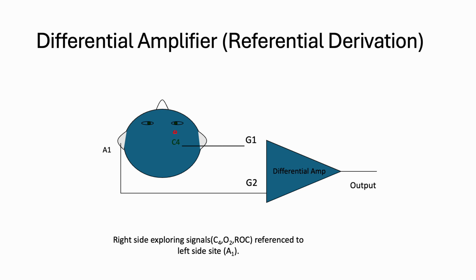So let's see. Let's just say this is F4 and O2, and let's say there and there. If we were to gauge, just eyeballing it, there, and there, versus here to here to here, because we've added just a little bit of distance, this one's really closer, then it gets a little closer, and then it travels a long way. This is the same, but adding distance makes those two differences not as bad as this one. So that's why we go from the opposite direction. The distance between electrodes has the potential to make a difference in the amplitude of the waves.